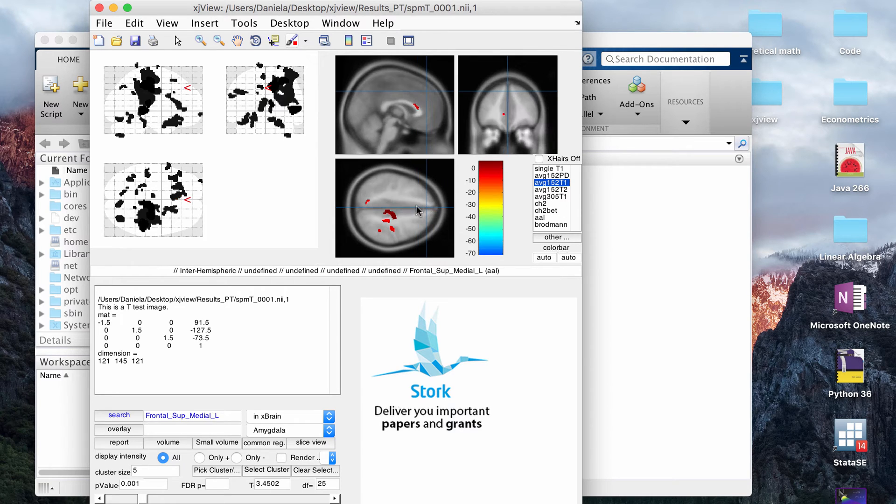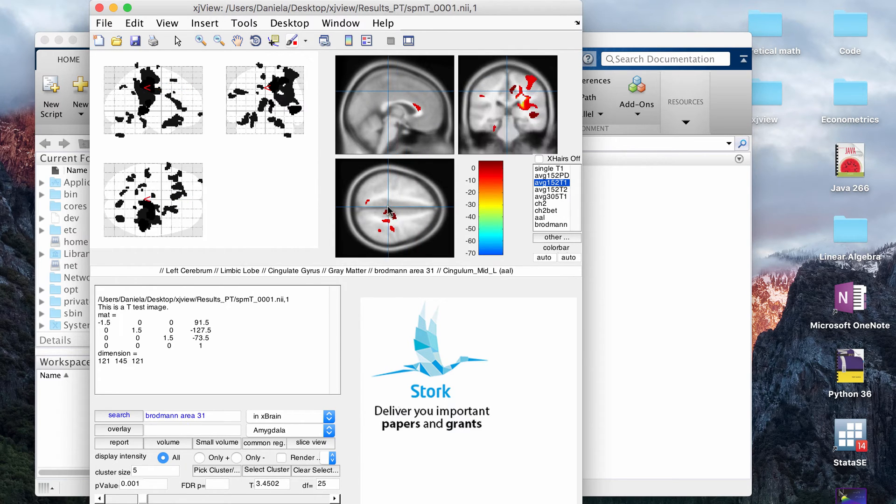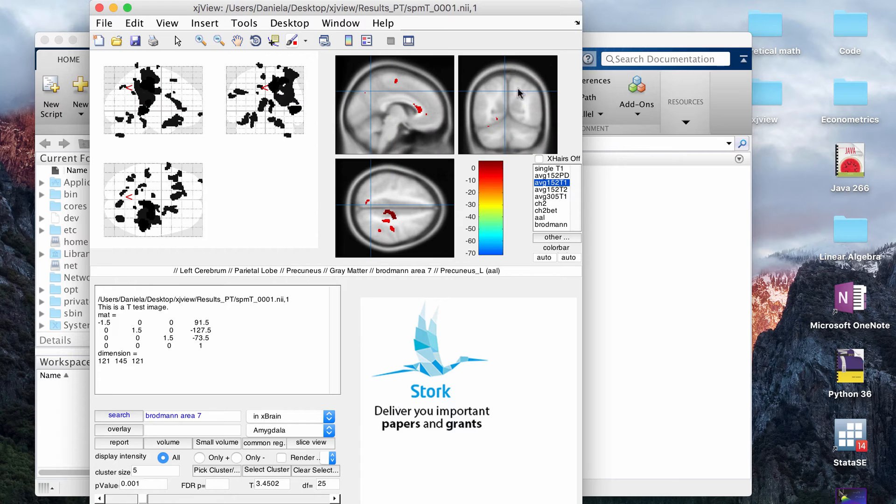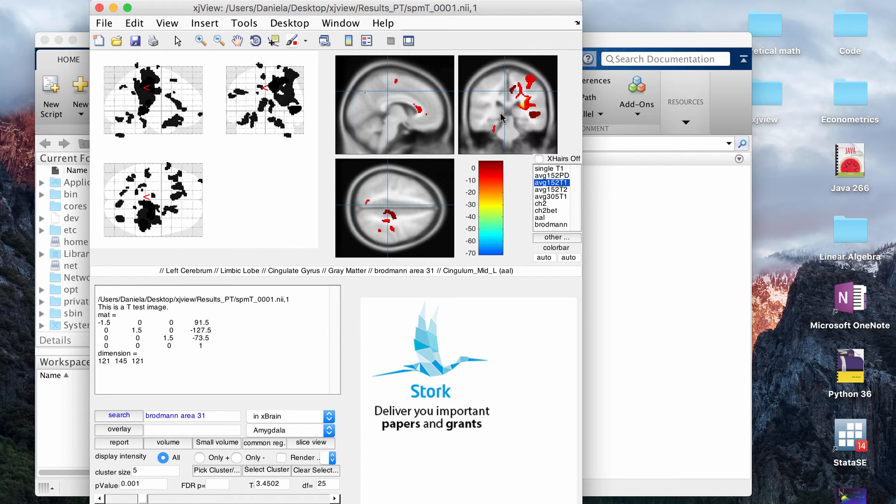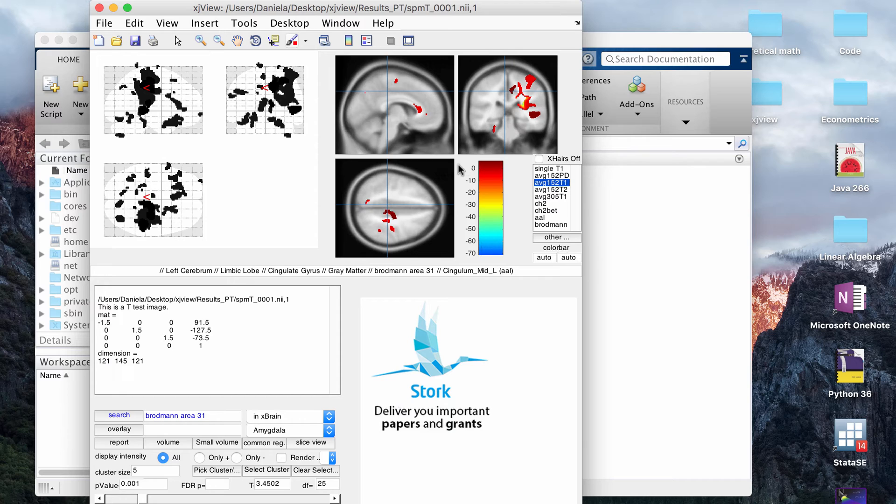Usually what I do is I will click along the axial and look at the coronal results here as exploratory analysis. When I load the files, the stuff that's showing up here are the T values and the values across the whole map are shown in this color bar here.